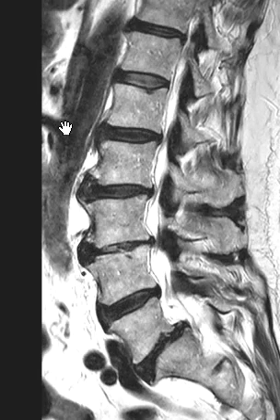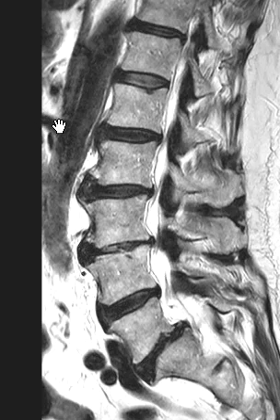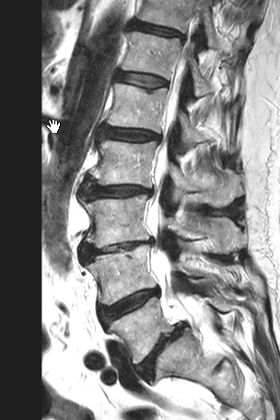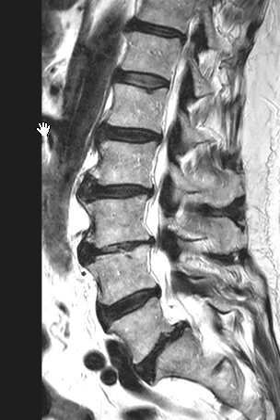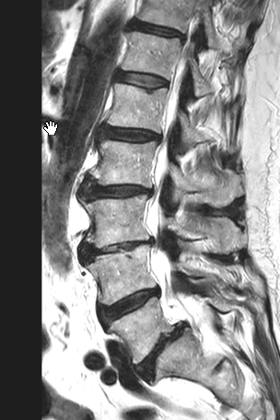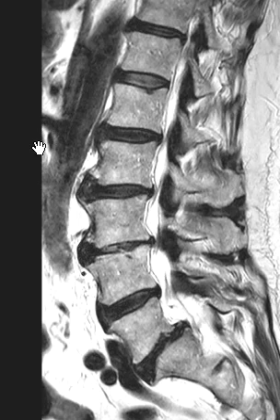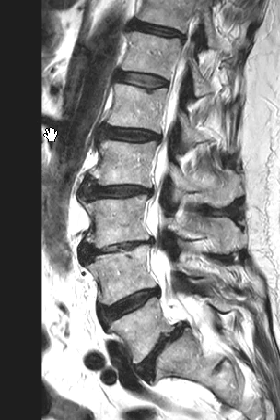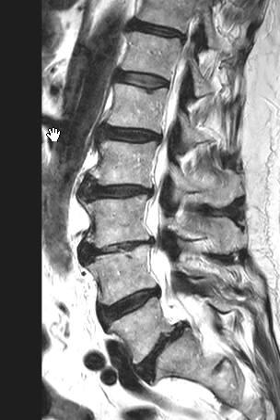We always look at the SMA origin here. This is the SMA — superior mesenteric artery — and this patient has a really high angle. This is 90 degrees. Usually it comes off at about 45 degrees, and if it's less than 20 or 22 degrees, that can be associated with SMA syndrome.